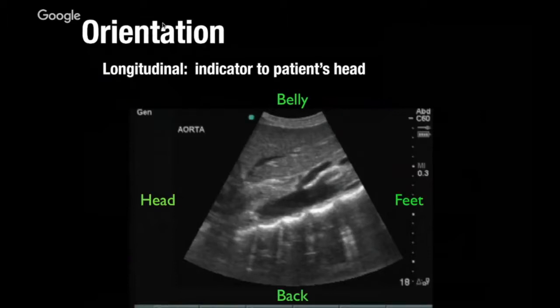And over time, you would be able to look at this shot and you wouldn't need anybody to tell you where the head and the feet are, because you would know that the aorta is deepest in this part of the body and becomes more superficial as you run inferior. You would know the SMA runs down, and it's the SMA that's the tiny dark stripe that's coming out there.